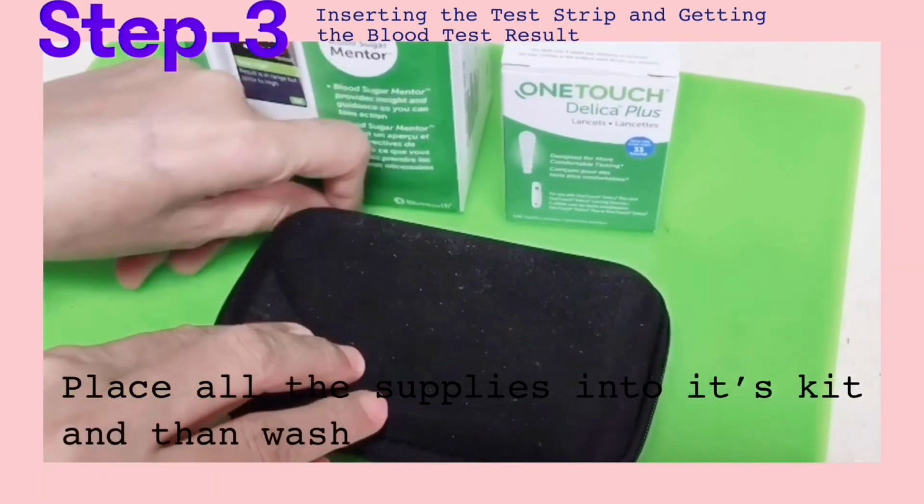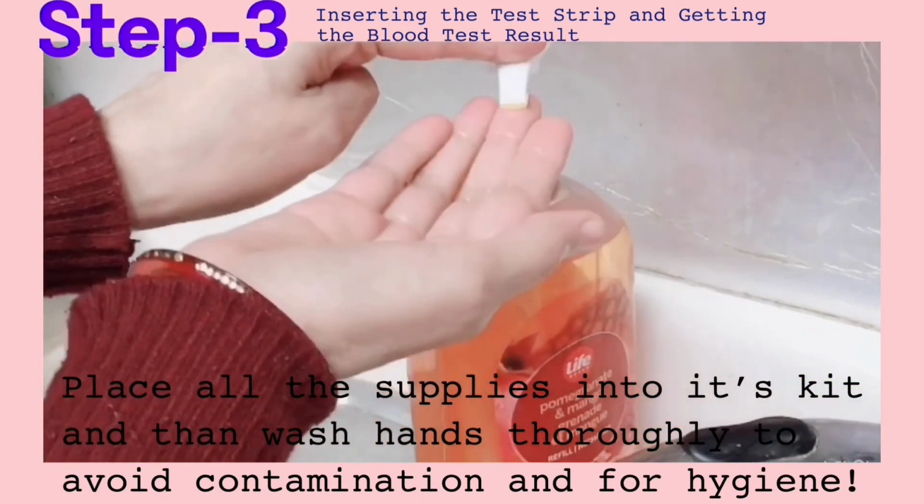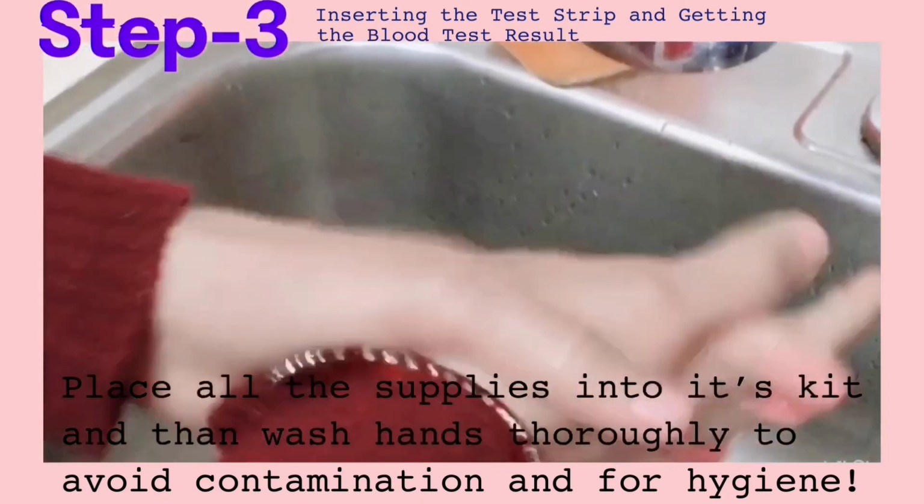Place all the supplies back into the kit and then wash hands thoroughly to avoid contamination and for hygiene.